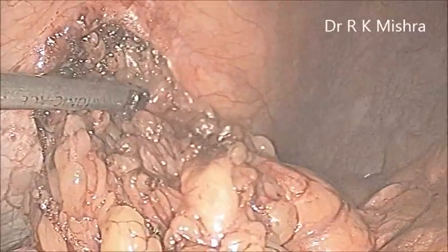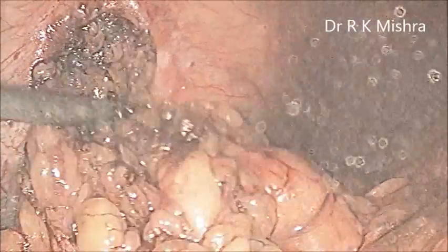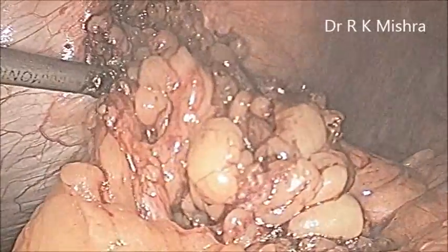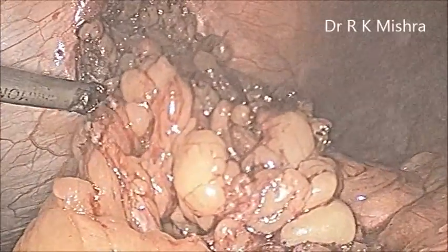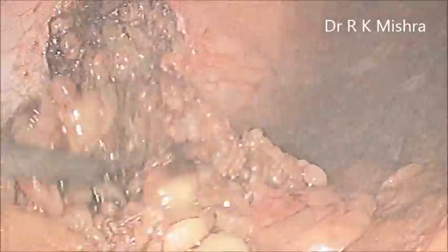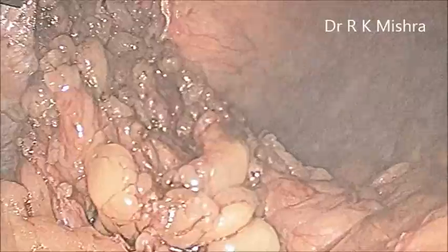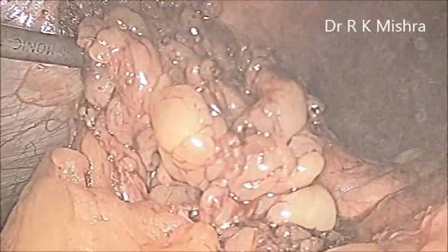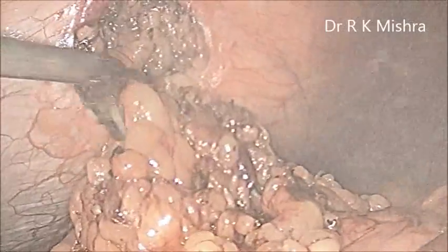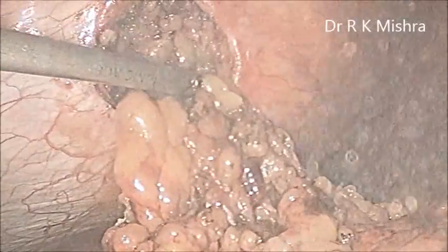Sometimes if a little fat is there, it will disorganize in due course of time. It is not necessary to remove 100% everything, because if you touch the skin with current and the skin gets necrosed or traumatized, there is a chance of fistualization — so skin should be respected. Some people pass a suture through the middle of the defect, but generally I never touch the bare skin at that point because the chances of infection are there. Now the adhesiolysis is almost complete.